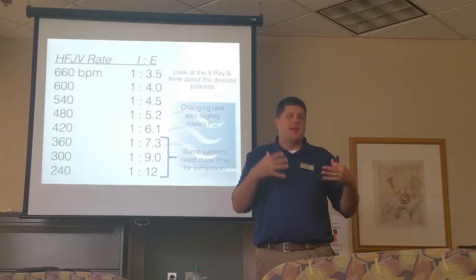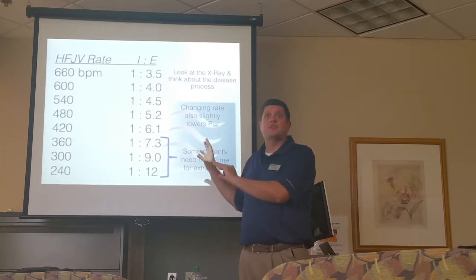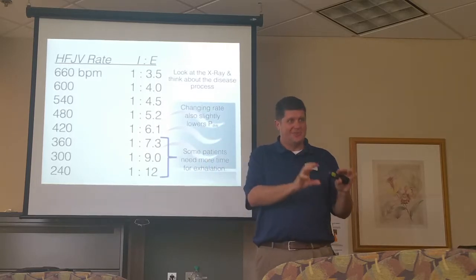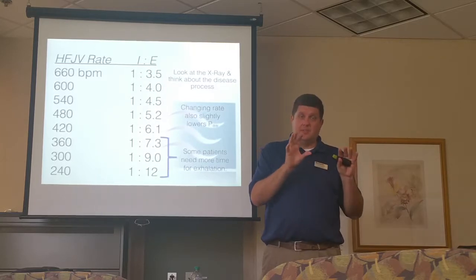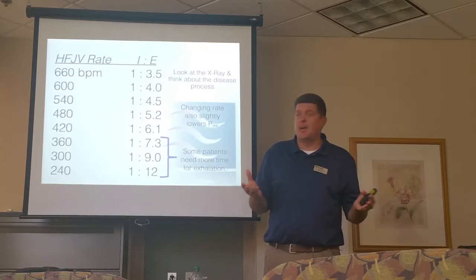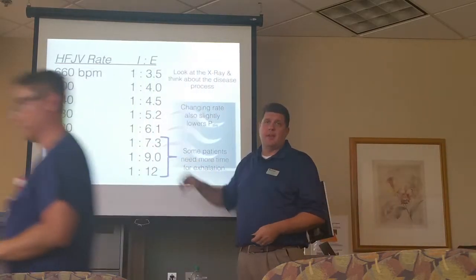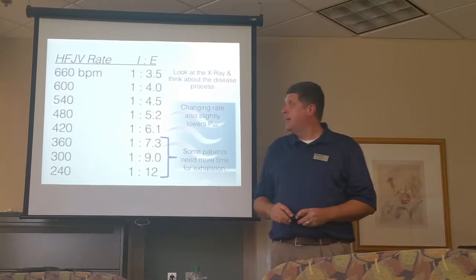The more they keep going up on the rate, they shorten the exhalation time, making the gas trapping worse. And this is not any different than what we do every day, which is the right ventilator strategy that fits the disease process we're treating. Just look at the baby, look at your X-ray, and ask would my patient benefit from a longer exhalation time? Then being down here would be where you want to go.